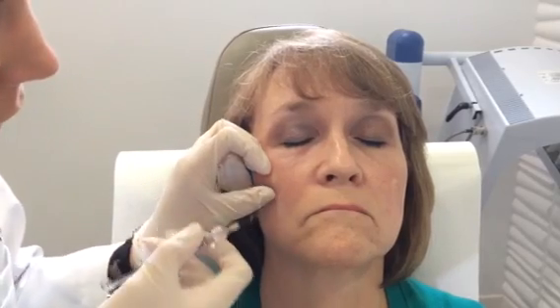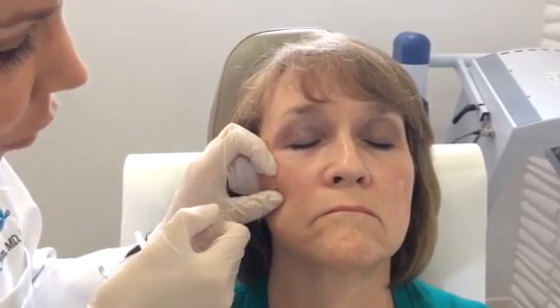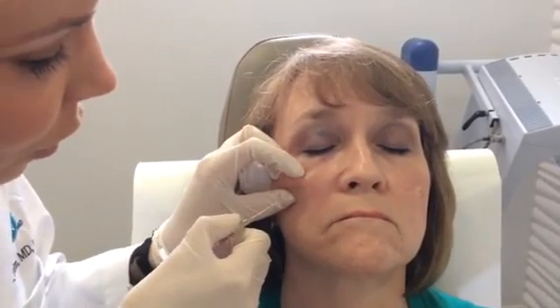In this particular patient, we're also going to do some global revolumizing of the face, doing a little bit of volumizing everywhere with a volumizing agent called Sculptra. With that, we're going to be able to give a little support to the cheek underneath the tear trough, which I think will be super helpful for this patient, for minimizing the appearance of the tear trough and supporting it after we're done with the filler. Actually coming over here and supporting that middle cheek. There's a deep cheek fat pad that, if we can support it a little bit, supports the tear trough and makes it minimized in that respect as well.